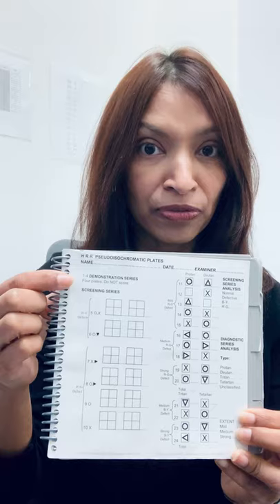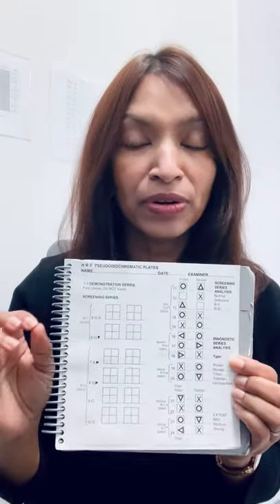If you want to go further and quantify or further qualify their type of color vision defect, you can do the rest of the plates, 11 through 24. They're slightly brighter — super-threshold plates. If you go back to the instructions in the front, there's a scoring sheet. The demonstration plates are not scored (plates one through four); these are the screening plates (five through ten); and here are the diagnostic plates. Based on how the patient responds, you can qualify whether they have a mild, moderate, or strong red-green defect, or a moderate or strong blue-yellow defect.